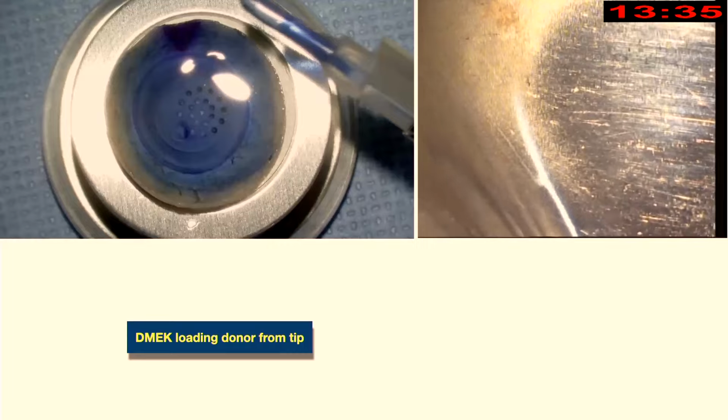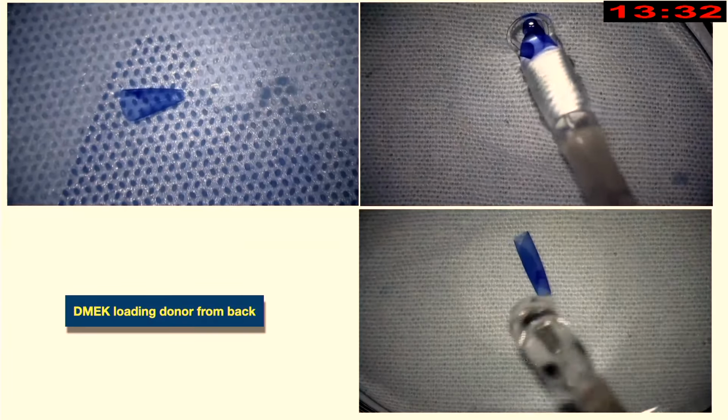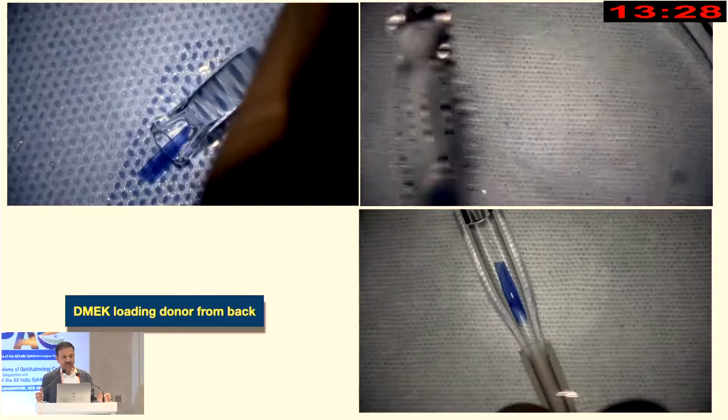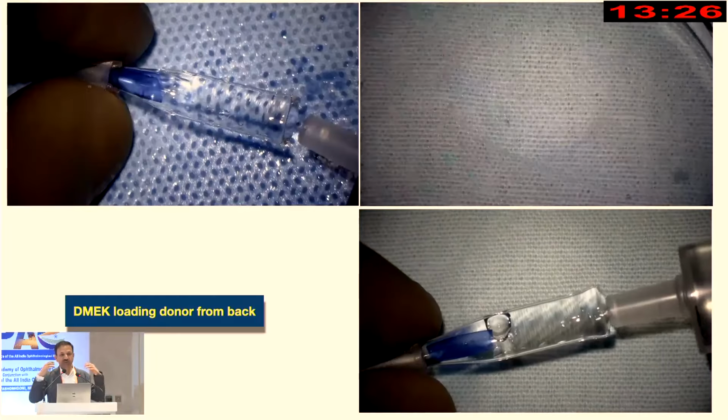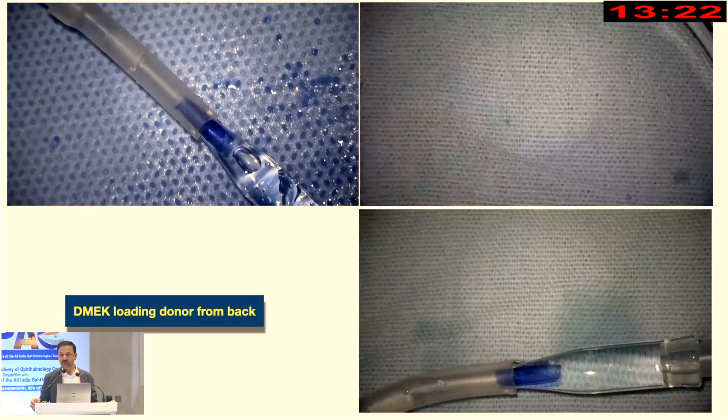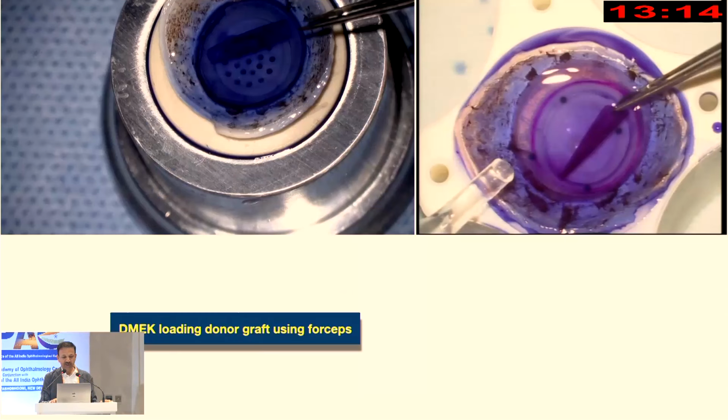This is loading from the tip. The other way is to load from the posterior end, which is the wider end. This is good, especially for scrolls that don't scroll up, a scroll that's remaining open. If you try to aspirate through the narrow tip, sometimes there can be shearing at the edge of the cartridge tip. Whereas here, because the opening is larger, it goes in much more gently.